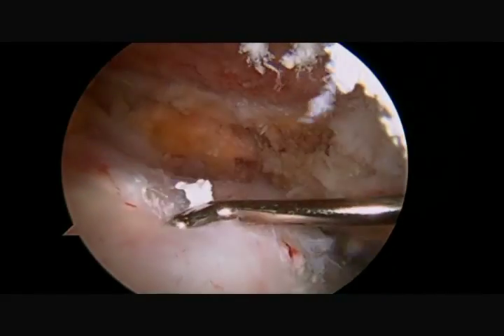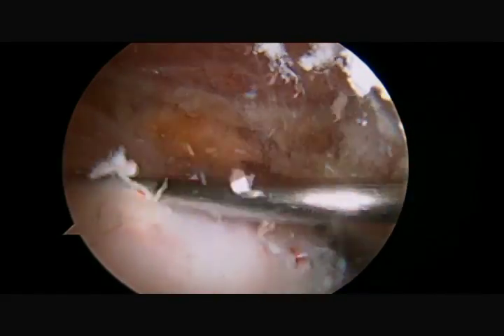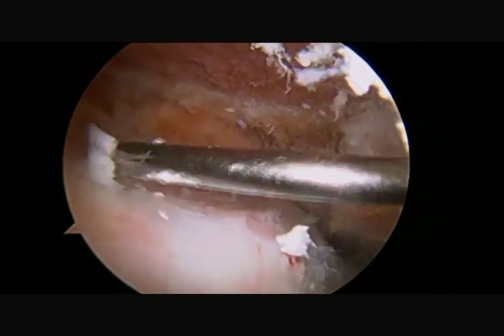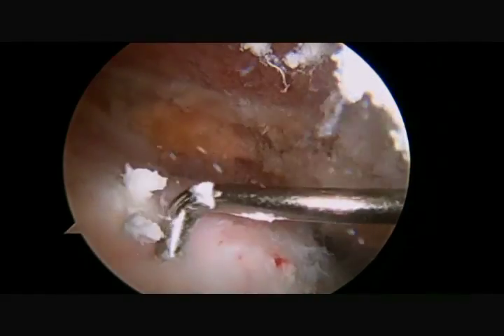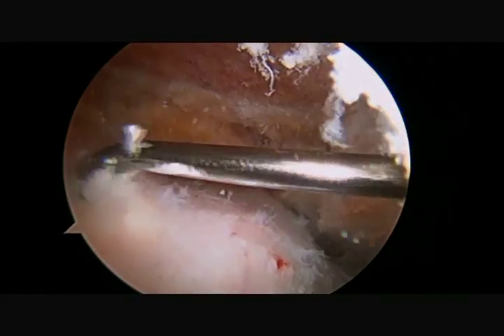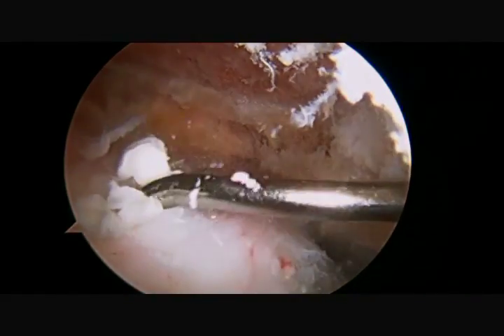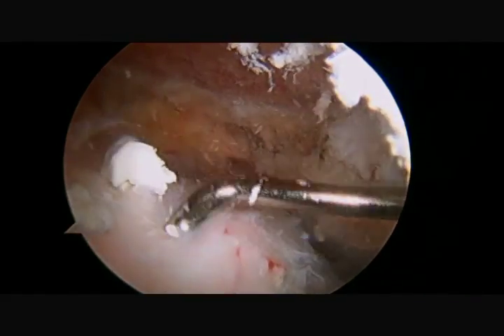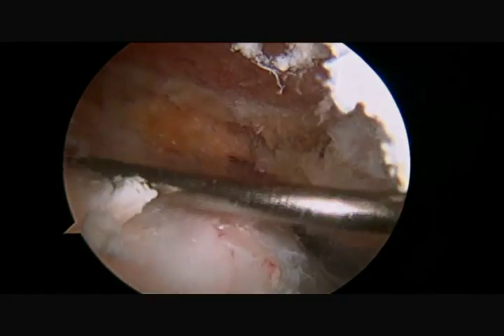a bursectomy and decompression is completed if indicated in the subacromial space. The top portion of the rotator cuff tendons is then thoroughly examined to identify the location of the calcific debris that was clearly seen on the x-rays.